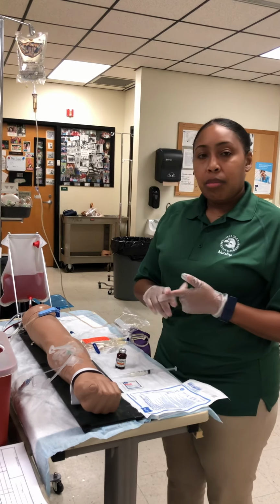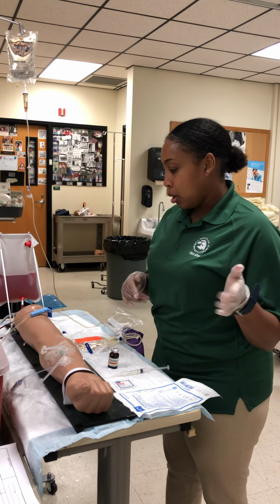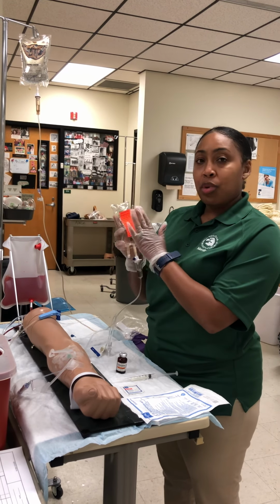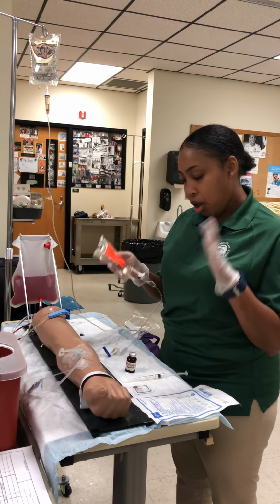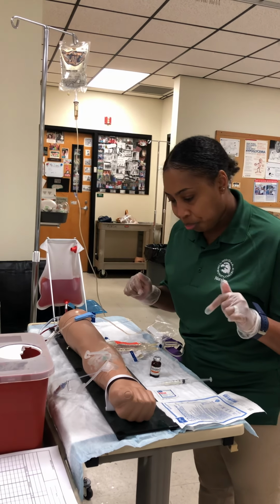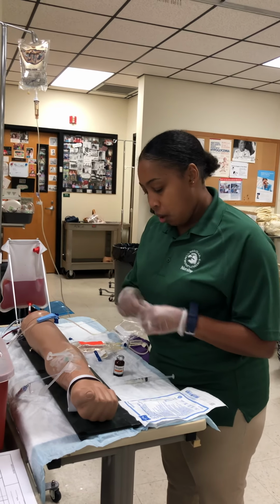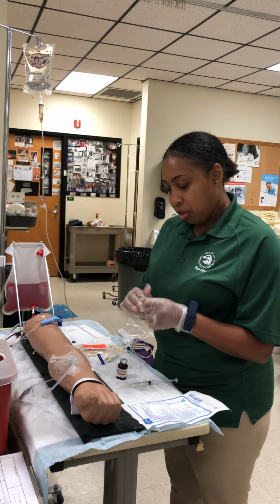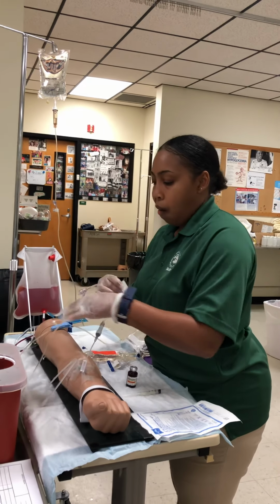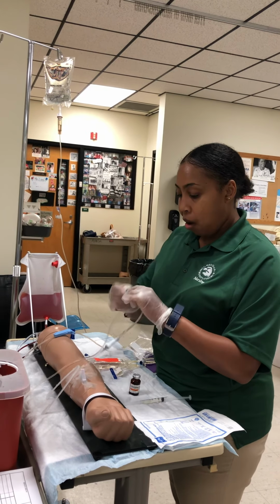And I'm going to also monitor to make sure that you are diuresing the way you're supposed to when I administer this medicine. For the gentamicin, I'm going to check to make sure that you are not retaining any urine with this gentamicin. And we'll check your blood pressure and monitor that also. So now we're going to get ready to clean the port closest to you. We don't have to flush because the fluids are compatible. So we're going to clean the port closest for 30 to 60 seconds.